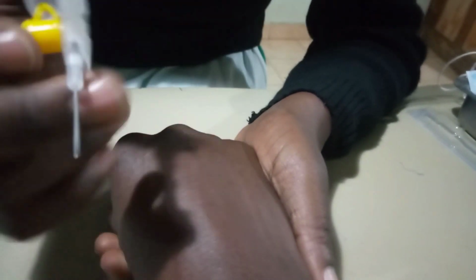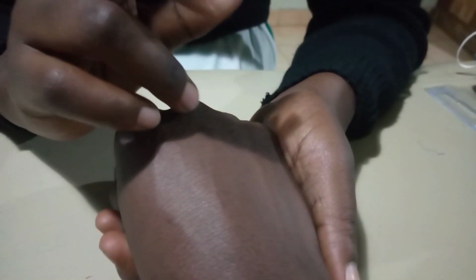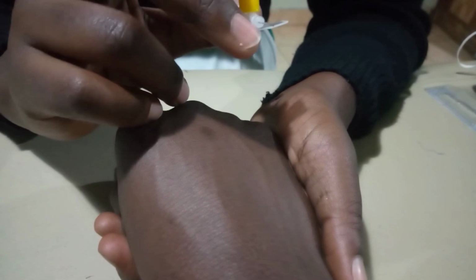Then if the vein is small, you use a small bore needle, a gauge like this, 24, for the small veins. And that does not matter whether it's a child or an adult. Even an adult with a small vein, you use gauge 24, which is a yellow cannula.